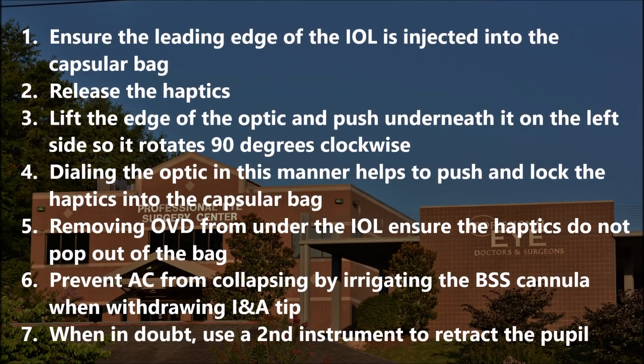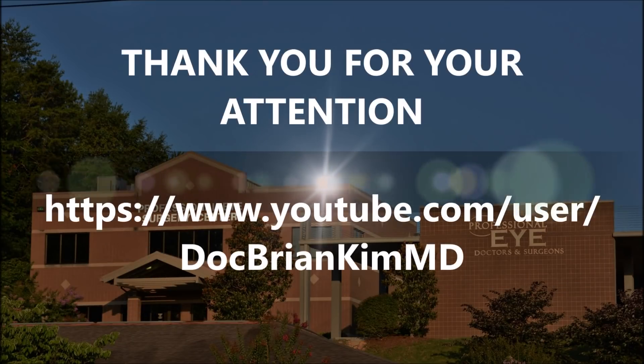In summary: ensure the leading edge of the IOL is injected into the capsular bag. Release the haptics using the I&A tip, then lift the edge of the optic and push underneath it on the left side to rotate it 90 degrees clockwise — tilting the optic so there is no zonular traction. Dialing the optic in this manner helps push and lock the haptics and optic into the capsular fornix. Remove the OVD from under the IOL to ensure the haptics do not pop out of the bag. Prevent the anterior chamber from collapsing by irrigating BSS when withdrawing the I&A tip. When in doubt, use a second instrument to retract the pupil. I hope this was helpful — thank you for your attention.